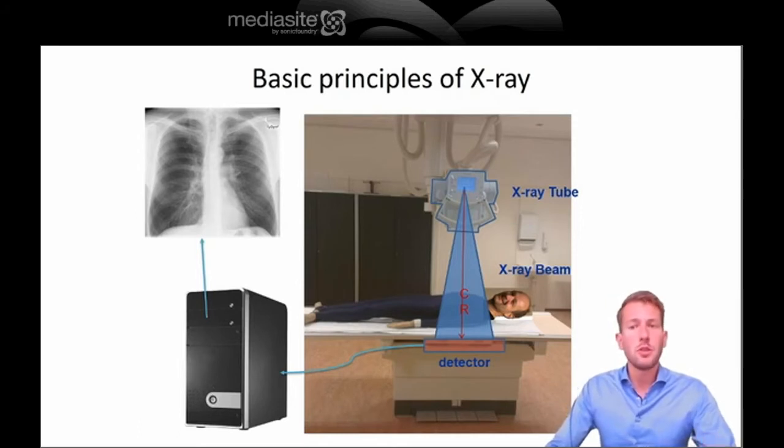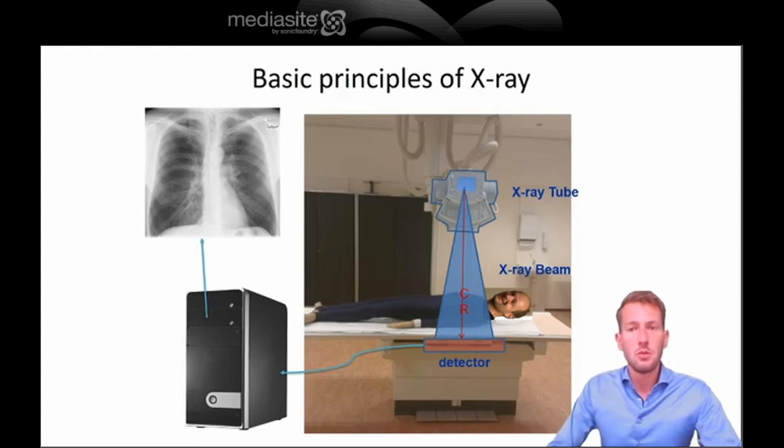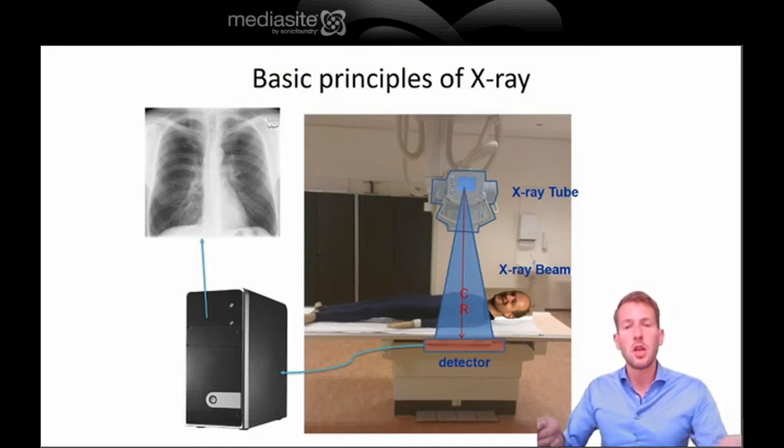Apart from this, a bucky room also contains a generator which produces the high voltages that is needed to produce X-rays. This generator is able to produce hundreds of thousands of volts. So you might not want to spill your cup of coffee over it, because that might turn ugly. Also, you see a sink, which allows for hygiene, and obviously a table on which a patient can lie. This table can go up and down with the pedals you see below, and also another pedal makes the table almost hover, which makes for easier patient positioning.